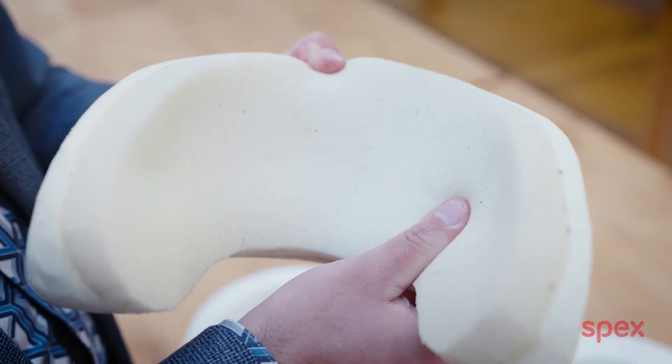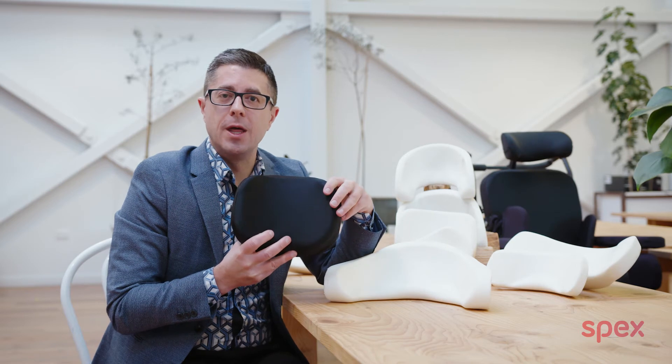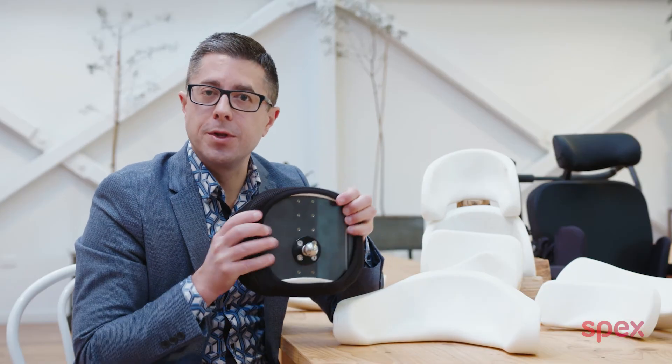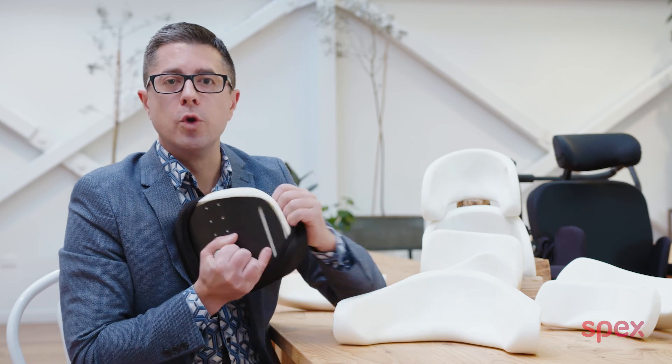The memory foam really enhances comfort for these people. We've also paid attention to the upholstery covers of our head support pads. The head support pads have a dual shear reduction cover, like you see with the new circle pad. This pad can now be quickly and easily removed for washing, keeping things sanitary.